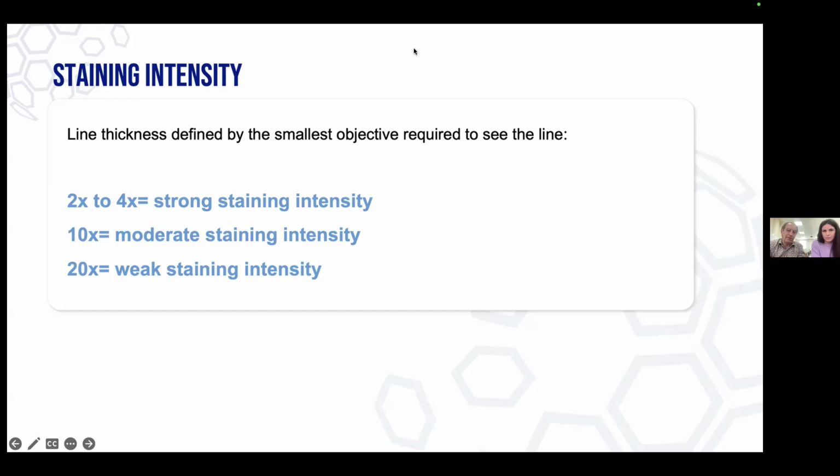You also need to understand, and we will show you why, that these numbers, times 20, times 40, times 5, are dependent on the quality of the lenses you use. So they're not universally the magnification. In fact, it's called the magnification rule, but it's not magnification. It is instead the quality of the lens.